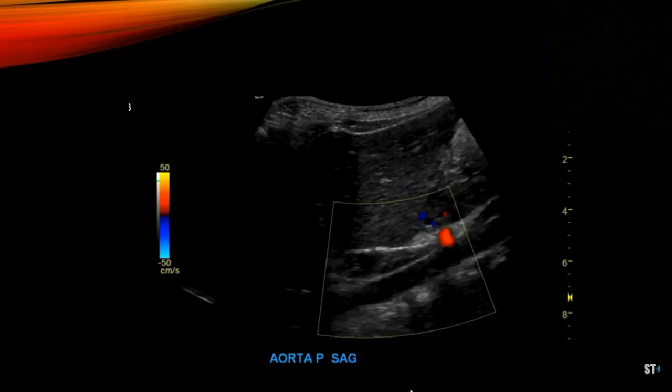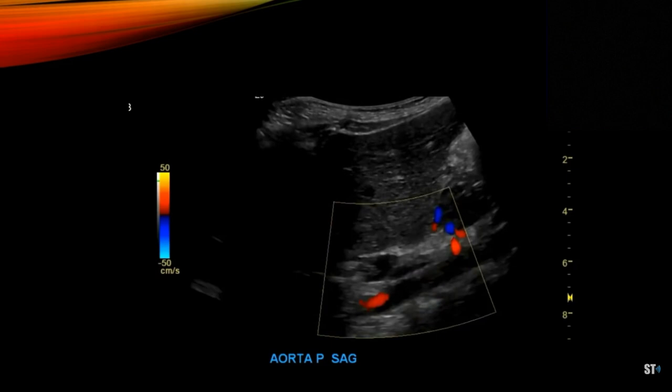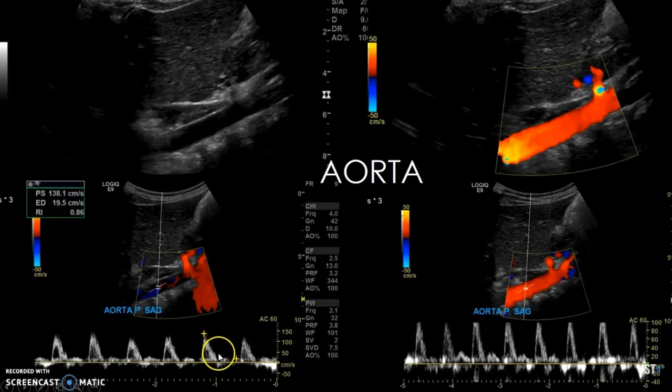When you begin your exam, you want to start in the aorta. Here's a clip showing the color flow in the aorta. You want to take grayscale images, color images, and spectral wave analysis. You can see a nice aorta waveform at 138 centimeters per second.